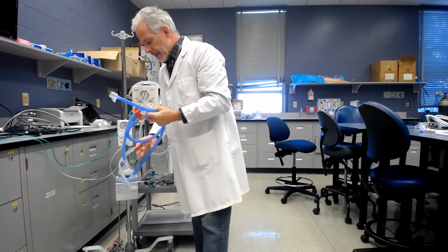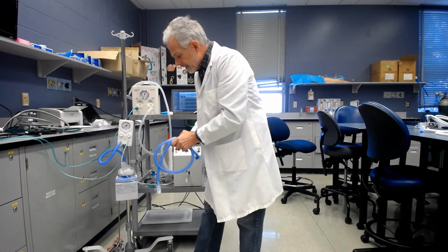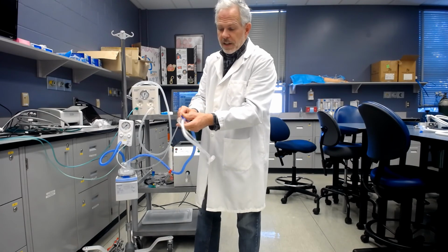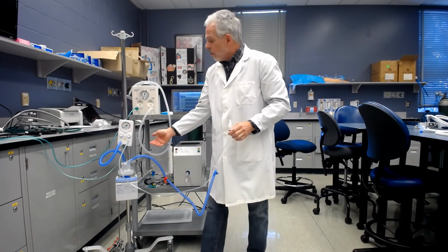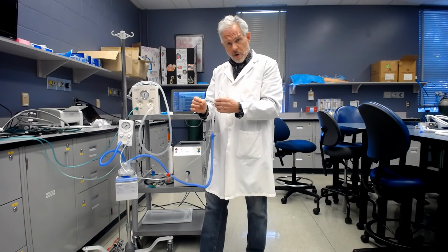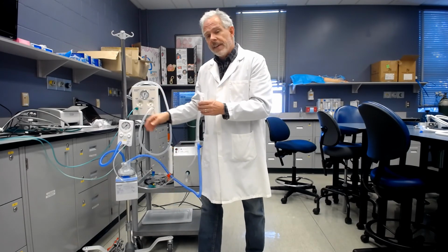All right, so I've just got a regular little connector here. I'm just going to plug in, delivering down to my heated humidity pod. And then we just have our regular ventilator circuit. Now, normally I would have the temperature probes in place, and then this just quickly and efficiently attaches. So now, with the standardized flow from a blender going into the rPAP, I can easily deliver heated humidity with CPAP therapy via mask or nasal prongs, or when delivering during a resuscitation, positive pressure breaths or CPAP with a mask or an endotracheal tube with heated humidity.